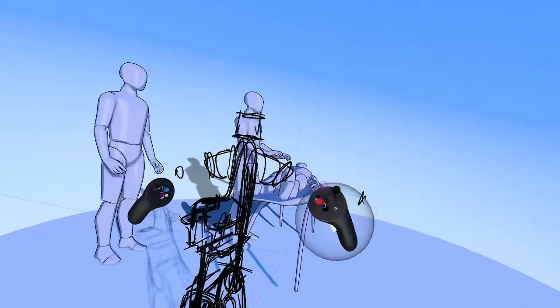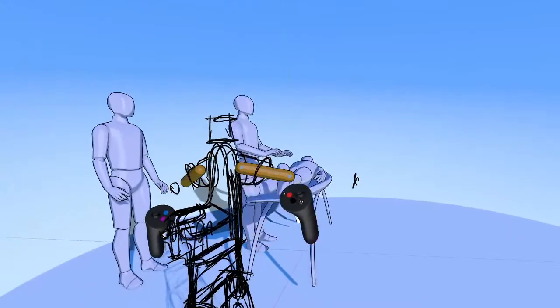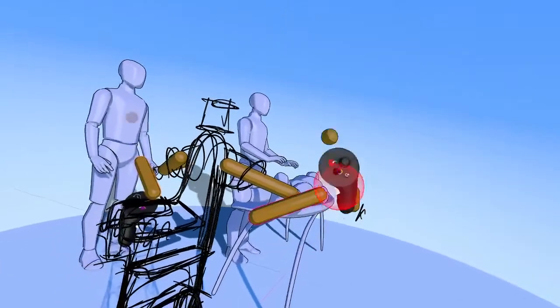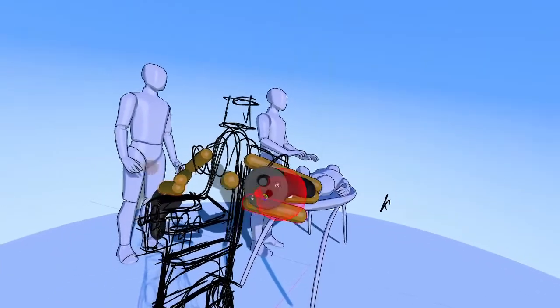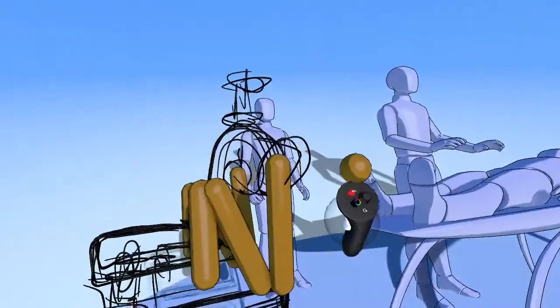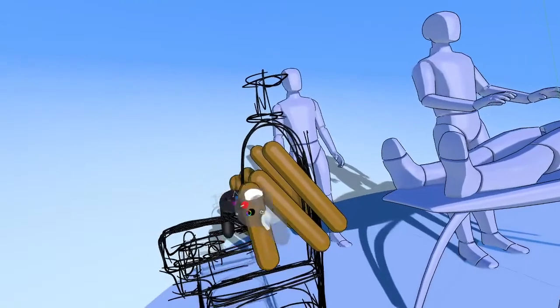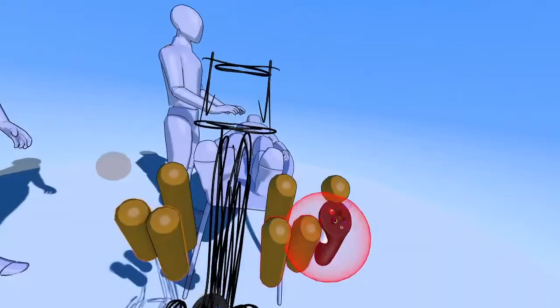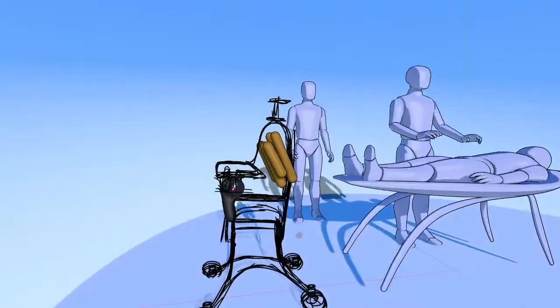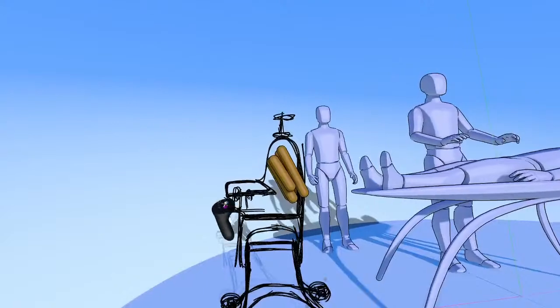We could probably make the arms, let's draw this with big bold lines first. Let me make it a different color. We could probably make the arms so that they're different sections like this, and then they at least somewhat fold into each other like that and compact. And actually, this is probably the best way of troubleshooting that right now, just with giant strokes like this. And yeah, that looks pretty good. Actually, that looks pretty compact, I think, at least. And I'm trying to think if we're missing anything else.